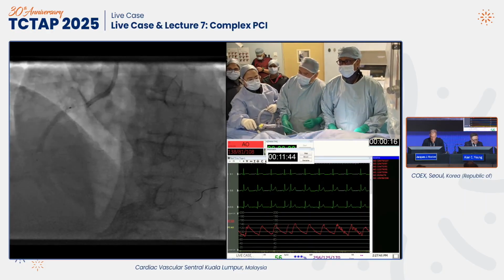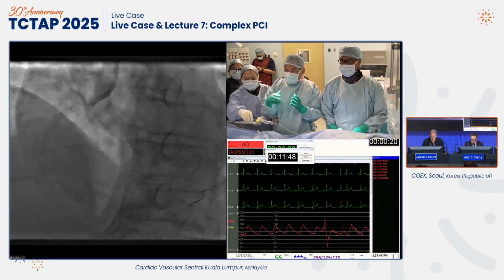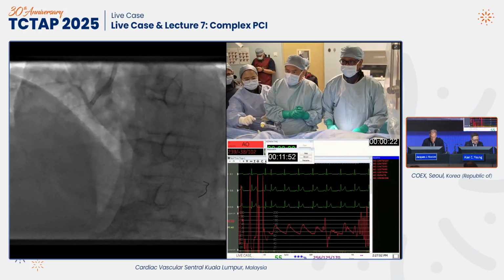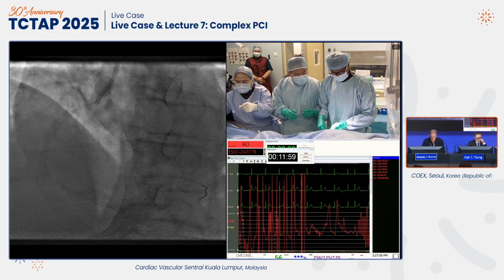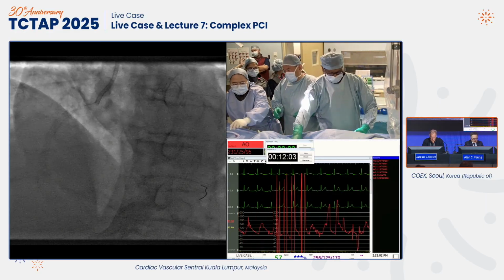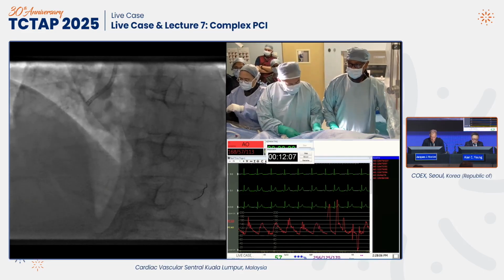Any particular reason you chose this stent, since you used Synergy down below, right? Yeah, number one, I suppose, is because it's a long stent, and it comes off the bundle, so it's a good choice. Number 2 is that, of course, Elixir is the producer of the bioadapter, and they are also the producer of this Lithix balloon, so it'll be just nice to put everything in. And more importantly, there are 2 large data sets that come along.